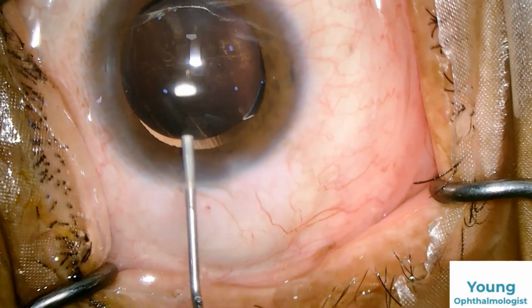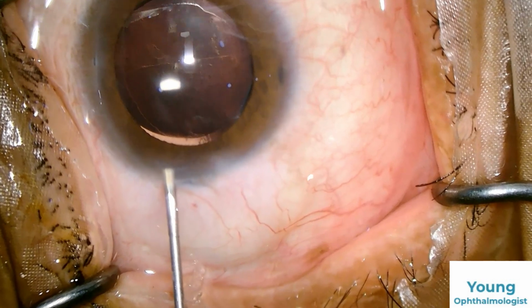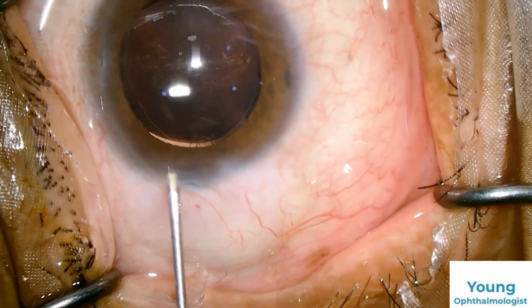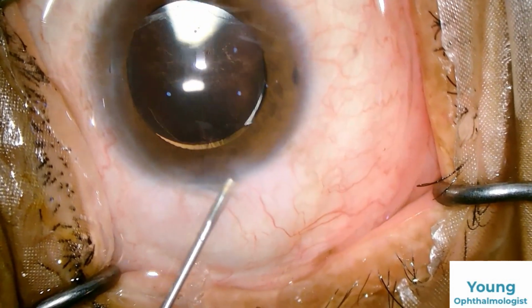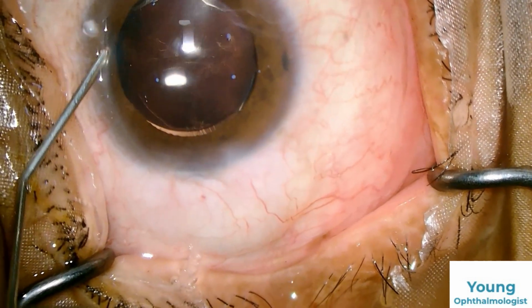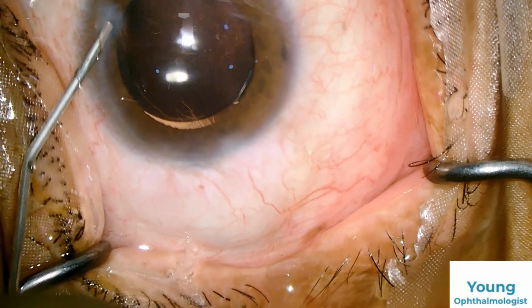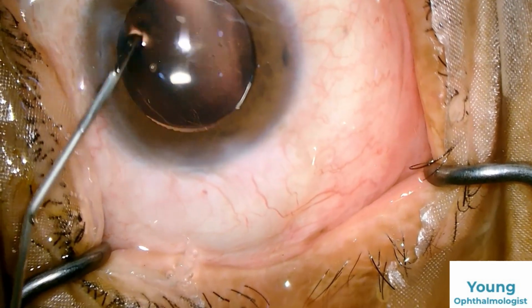Here you can see one thing I was observing, that my tunnel was not a complete 1.5 mm in length. It is a little bit shorter. But the chamber formed well. I didn't feel like putting a suture.